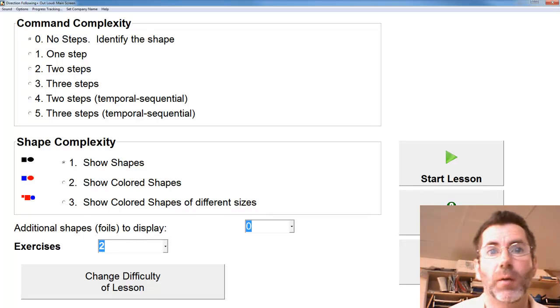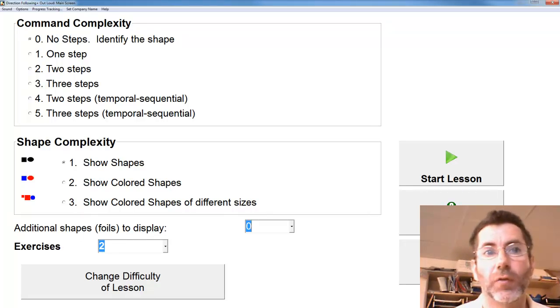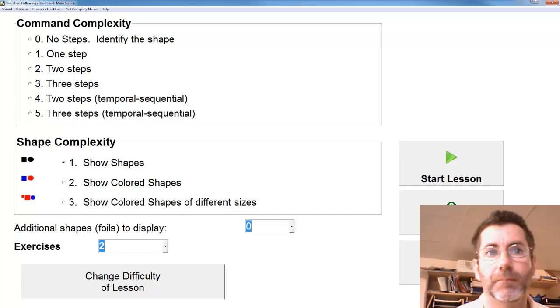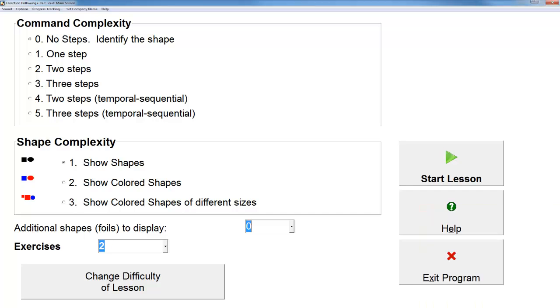Hi, I'm Clay Nichols. I was the lead engineer working on this program and I'll be giving you a short demo of it. This is Direction Following Out Loud for auditory comprehension, reading comprehension, attention and memory.